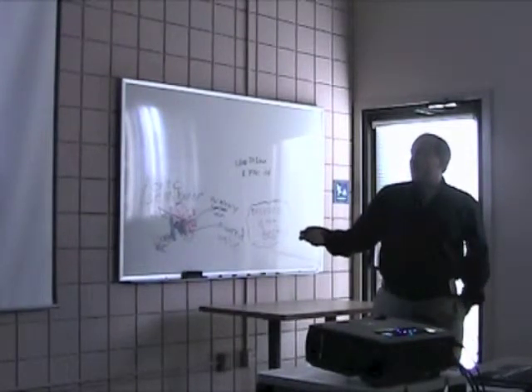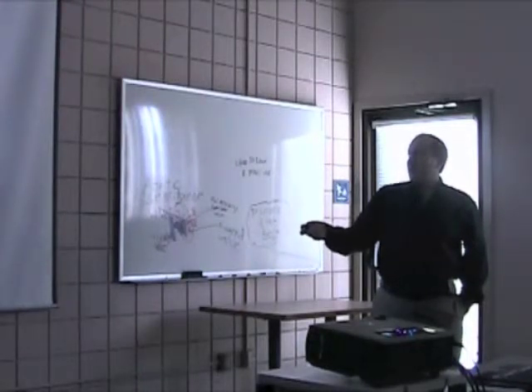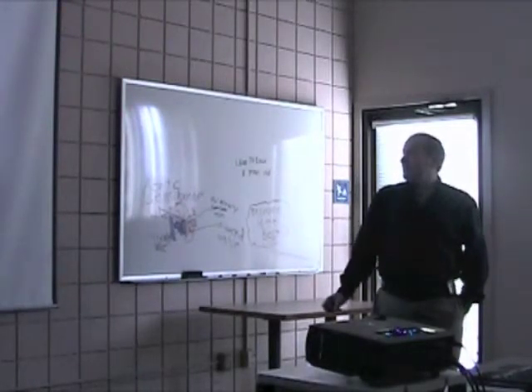So that's the ascending aorta that has been replaced there. That's sewn in around the valve. And then they're going to plug the coronary arteries into that as well.